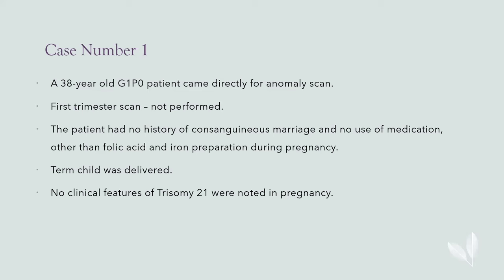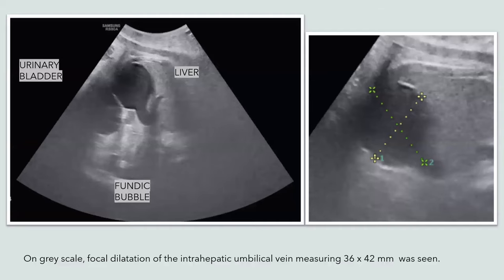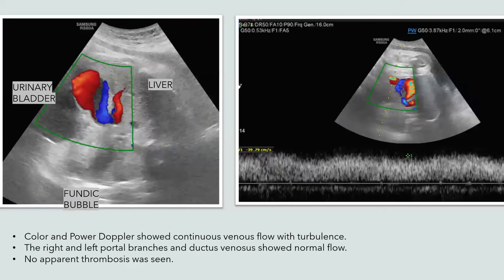A 38-year-old G1P0 patient came directly for a anomaly scan. The first trimester scan was not performed. A term child was delivered. No clinical features of Trisomy 21 were noted in pregnancy. On grayscale, focal dilatation of the intra-hepatic umbilical vein was seen, measuring approximately 36 by 42 mm. Color and power Doppler showed continuous venous flow with turbulence.